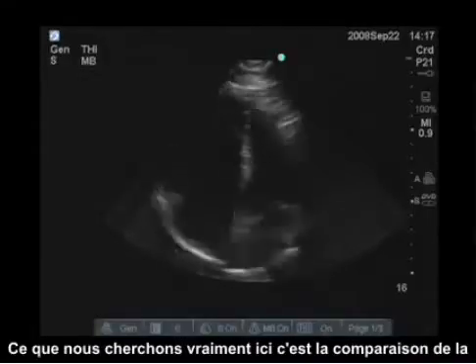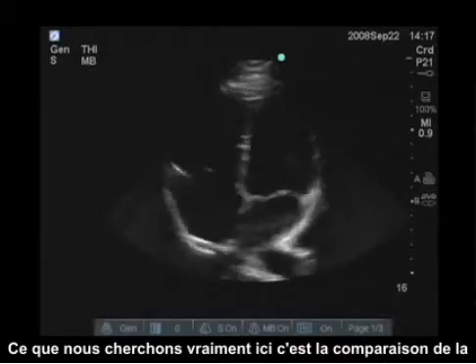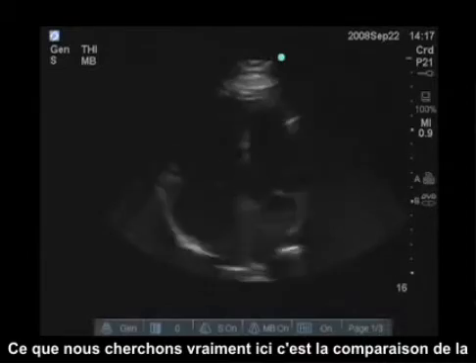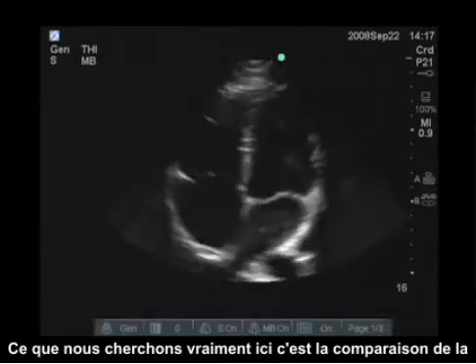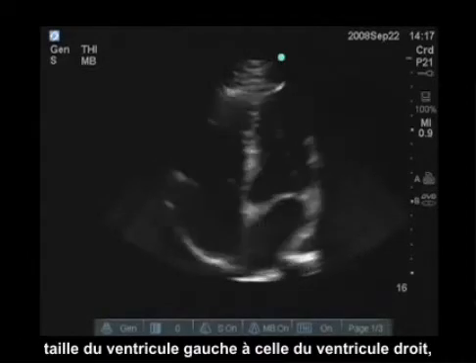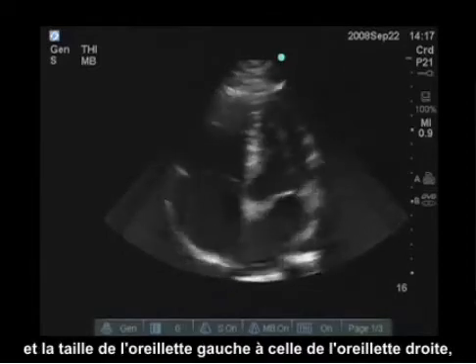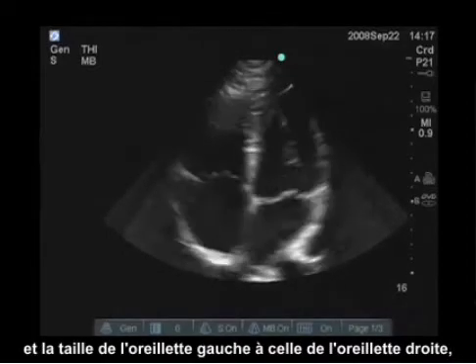What we're really looking for here is a comparison of right to left side — the size of the left ventricle to the right ventricle, and the left atrium to the right atrium.